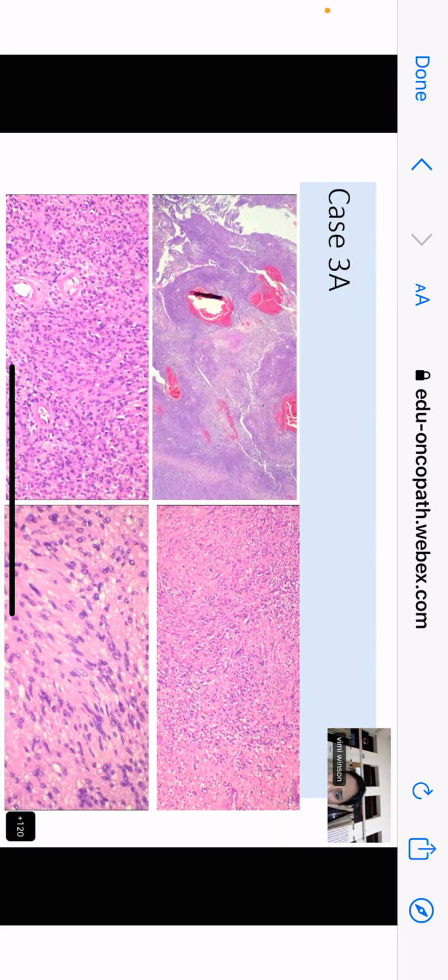So what do you mean? It is actually arising from an endothelial cell. Is that what you're saying? No, ma'am, it's not from the endothelial cell. Then when you say it's a vascular lesion, what do you mean? Every lesion is vascular, no? It is arising from the periendothelial cell. So you think it's a hemangiopericytoma, or a myopericytoma, or what? Glomus tumor, ma'am, glomangioma. Glomus tumor. Okay. Very good.